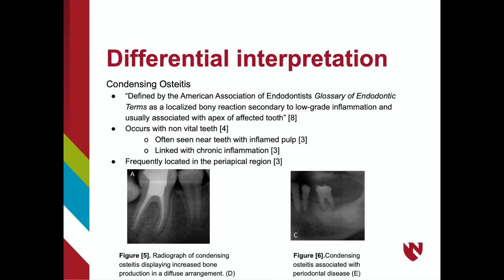Figure 5 is an example of condensing osteitis, displaying increased bone production around endodontically treated, non-vital tooth number 30. Figure 6 displays condensing osteitis associated with periodontal disease on a molar in the left lower quadrant.